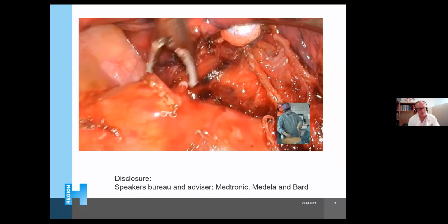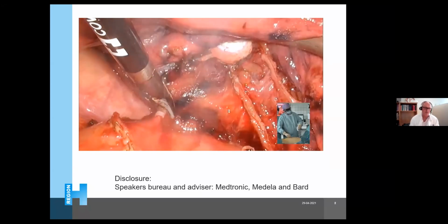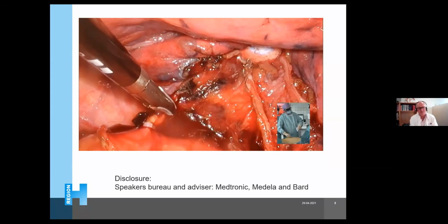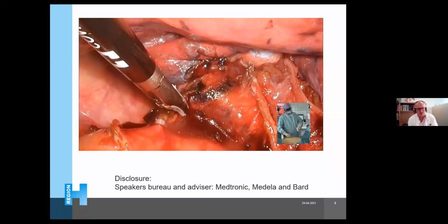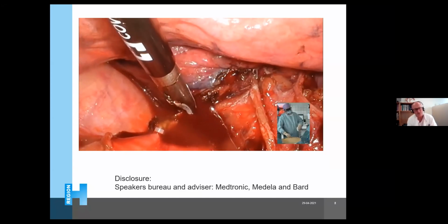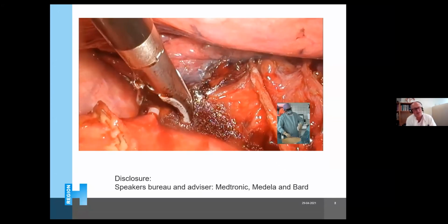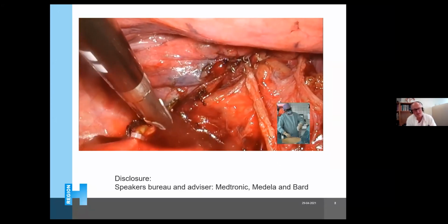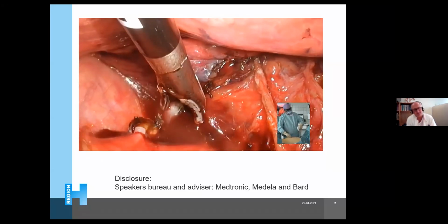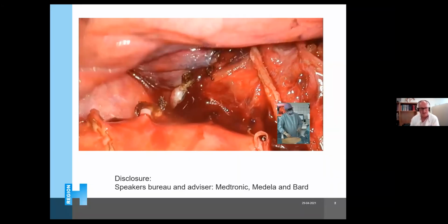So this is a left upper lobe lobectomy, fissureless, doing the posterior artery, a small branch, putting on a Hem-o-lok clip, and then taking it with an energy-based device. And you do see this oozing, this bleeding. So really, as a surgeon, stay calm, go on, and be prepared to address it. You should always have a plan whenever you see a problem. So at the end, this one could actually be dealt with by the energy-based device and didn't have any need for additional hemostatic agents.